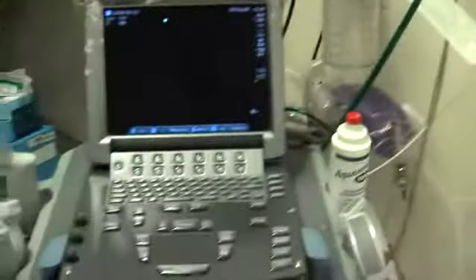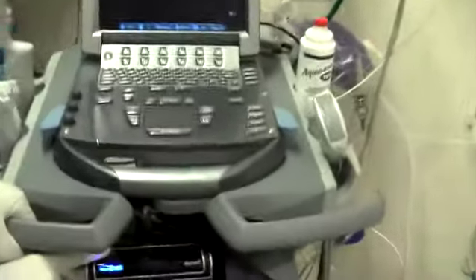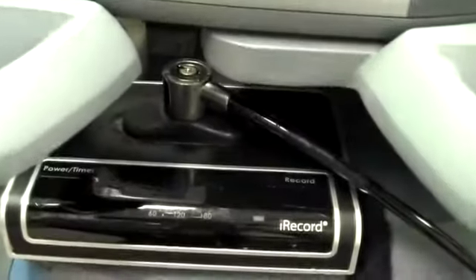So you hit the power button here on the left of the iRecord. I have to hold it down. You've got to hold it down for a second. It fires up.